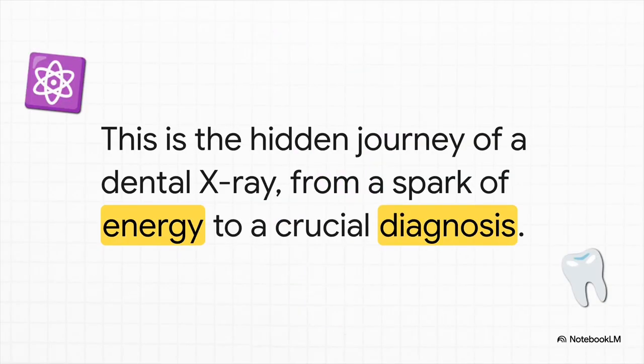Well, today we're going to follow that hidden journey. It's a wild story, really. It starts with just a spark of energy, and it ends up being a super important diagnosis. And in between, just a whole lot of physics, a bit of geometry, and honestly, some pretty serious detective work. So yeah, let's dive in.